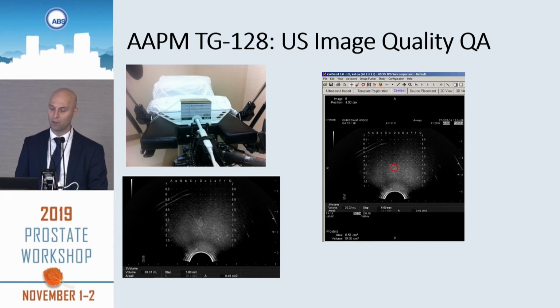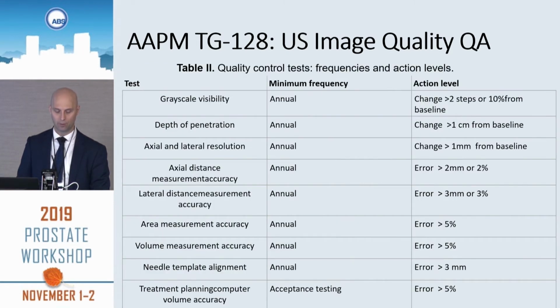TG128 is guidance for ultrasound QA, and there is a commercially available phantom for performing TG128 tests to evaluate the accuracy of your image. Here's a quick breakdown. It's not a short list, but you can accomplish all of these tasks in half a day to a day.